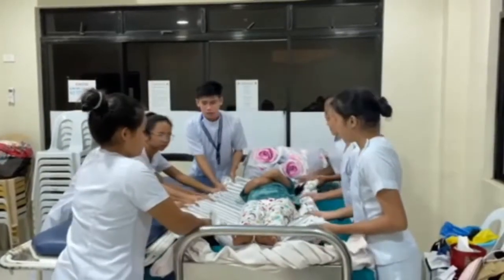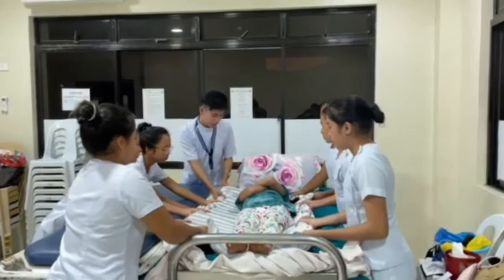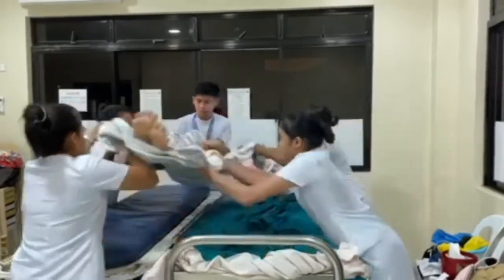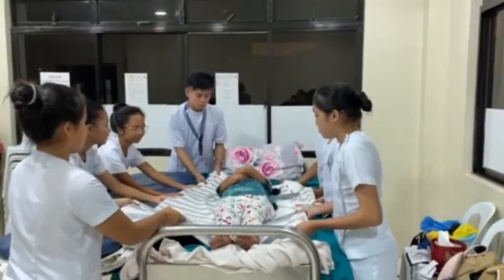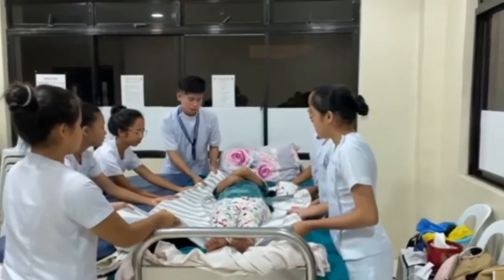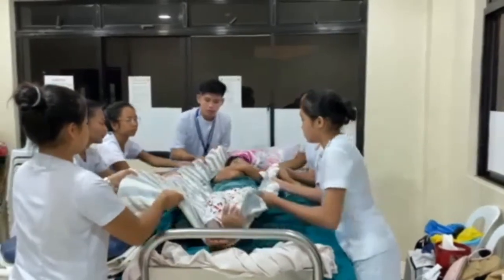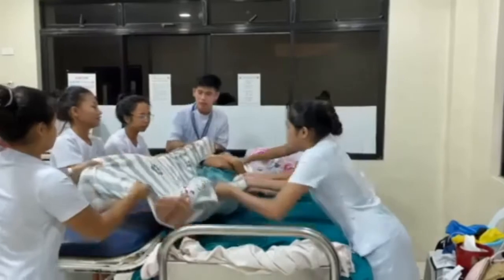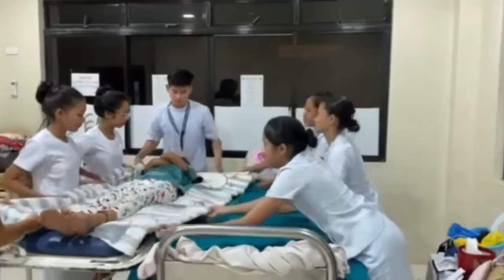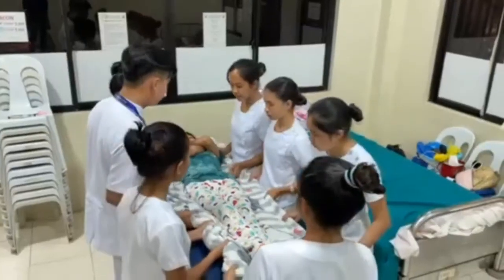All caregivers should position their feet in a walking stance. Ask the client to flex the neck during the move if possible, and place the arms across the chest. On a planned command, the caregivers at the stretcher side pull, shifting weight to the rear foot. The caregiver at the bedside pushes the client toward the stretcher, shifting weight to the front foot.